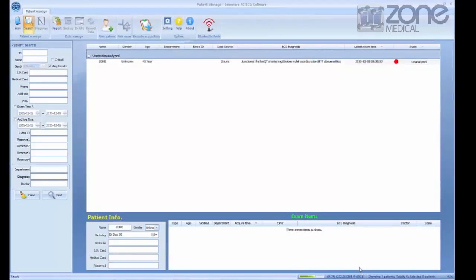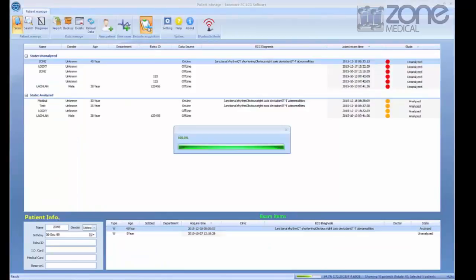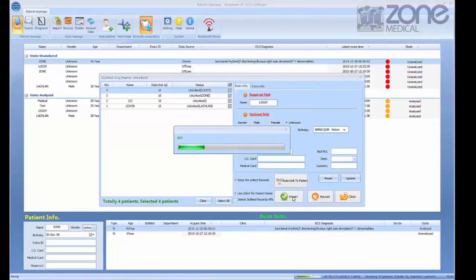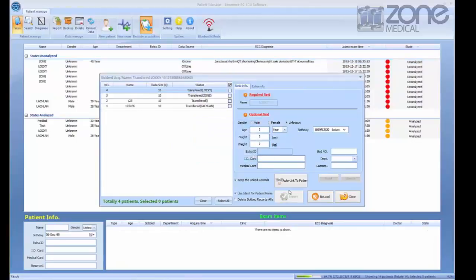If you disconnect the device from the PC, you can do a bedside acquisition by clicking the bedside acquisition button. This allows you to take as many ECGs as you like with new or existing patients, then reconnect to your PC later and import all patient data.